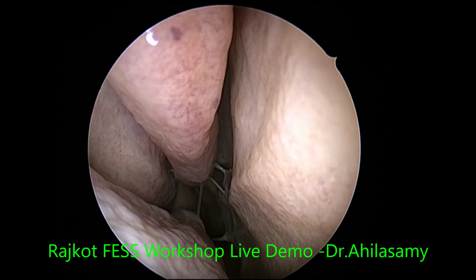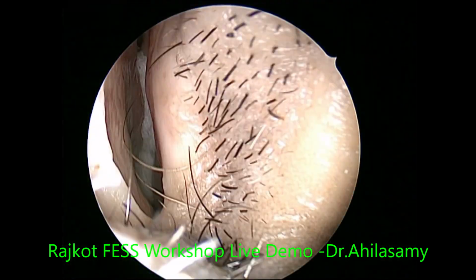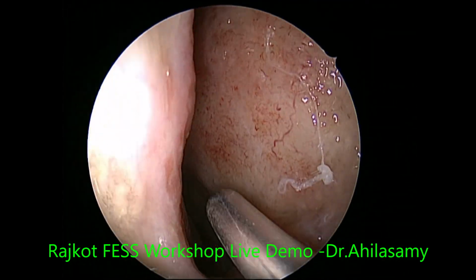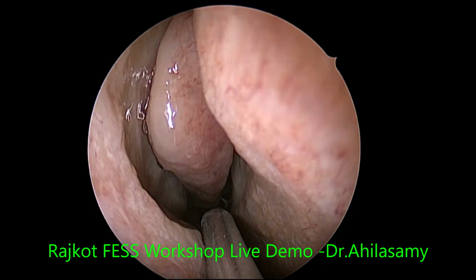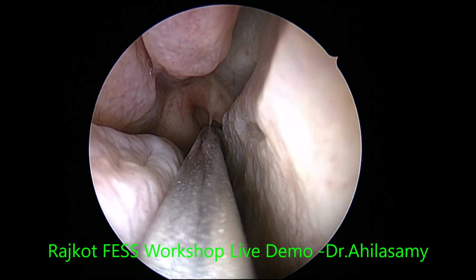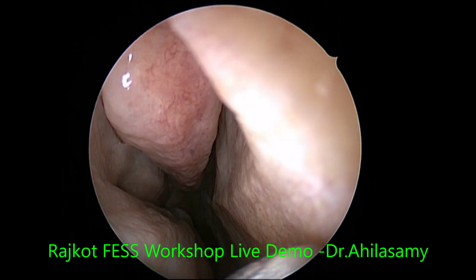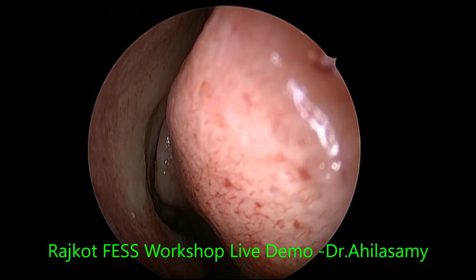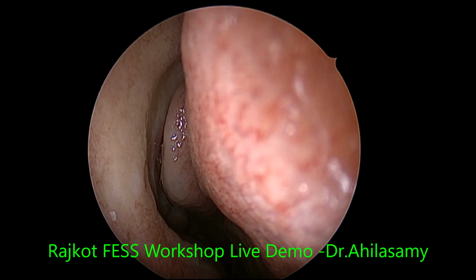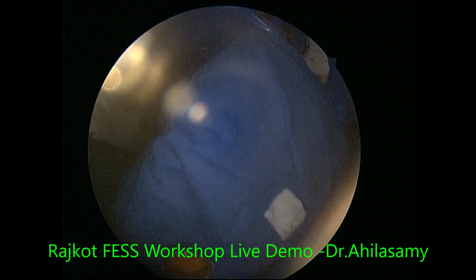So I think I will avoid that. I think there is working space down below the high septal deviation, so that I may not require a septal correction. In this case, I can manage without a septal correction. The middle turbinate is a little bulky. Anyway, I will be trimming the lower half of the middle turbinate. That's the choana. So I have enough working space, even though there is a slight septal spur to that side, not gross enough to distract. There's a high septal deviation. If you are doing a DCR or a frontal sinus surgery, then you have to correct the septum.